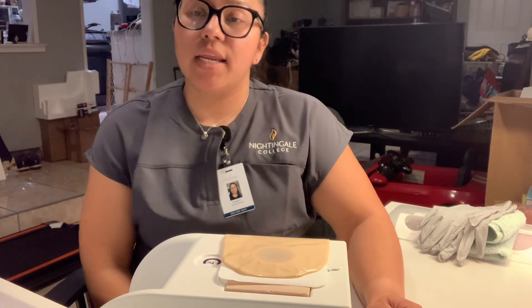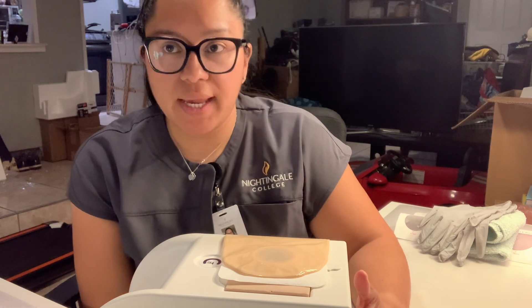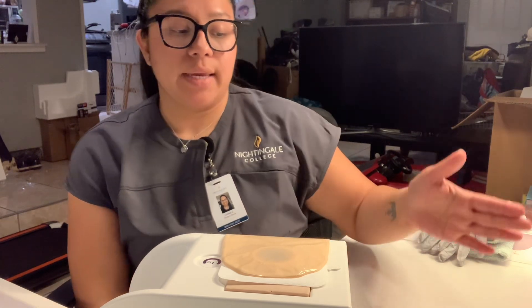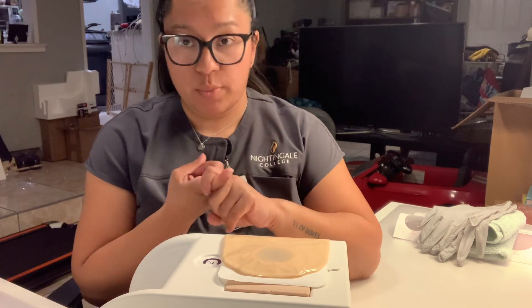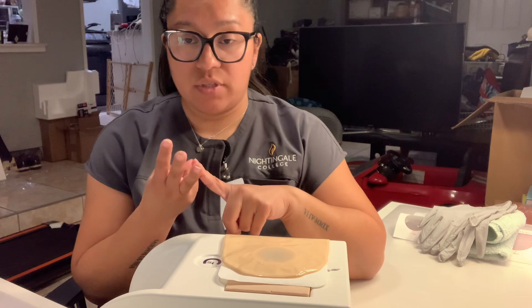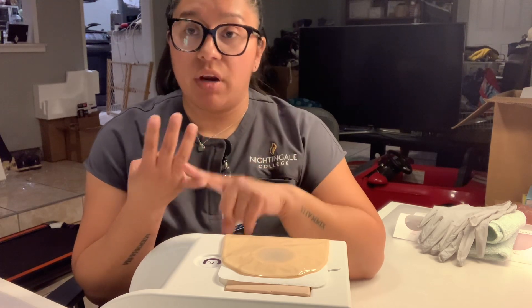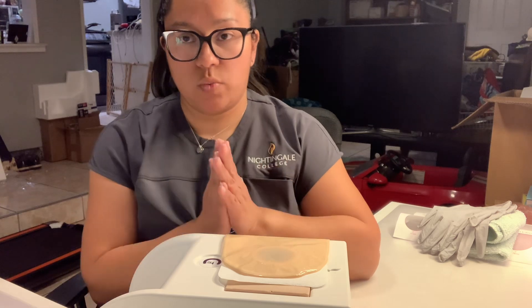Hi, my name is Crystal Conde and today I'm going to be going over my skills video for colostomy care. I'm going to start first by coming into my patient's room, closing the door behind me to provide patient privacy. I would perform hand hygiene, introduce myself to the patient, verify my patient, and also explain the procedure to my patient as well.